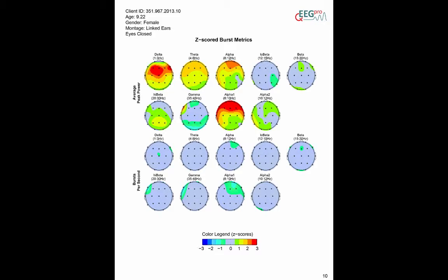The results of the percentage deviant activity analysis are relevant for designing neurofeedback protocols, since it can provide a starting point for providing feedback about the presence of deviant versus non-deviant activity.